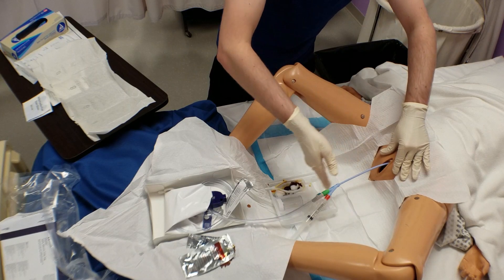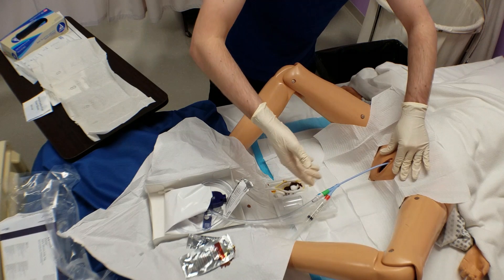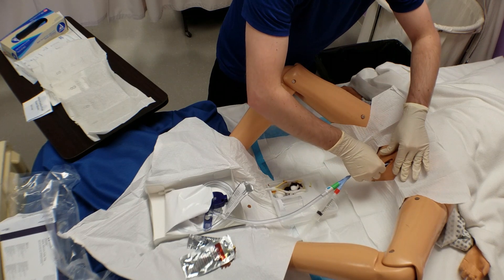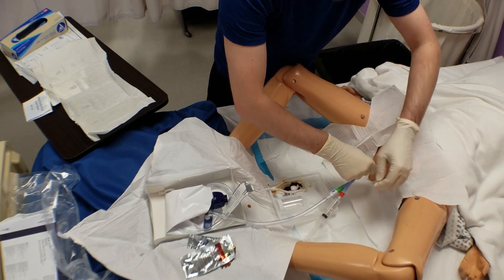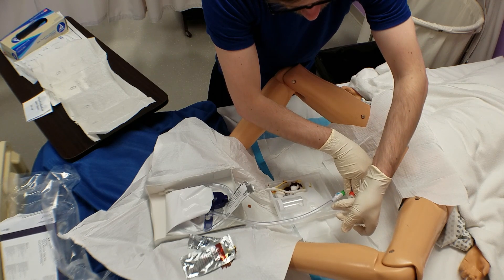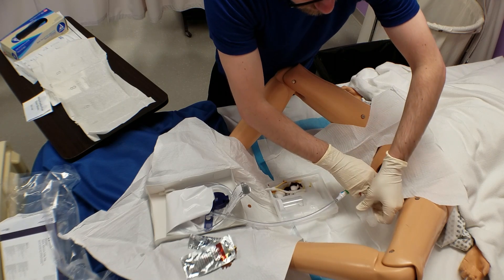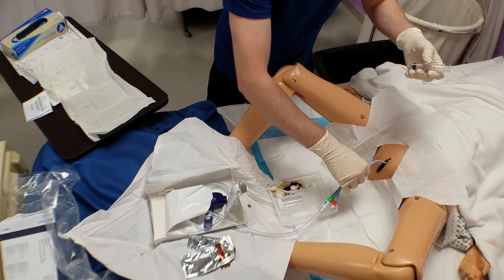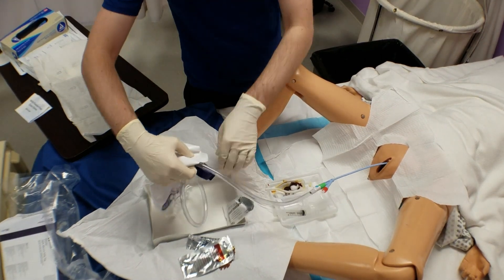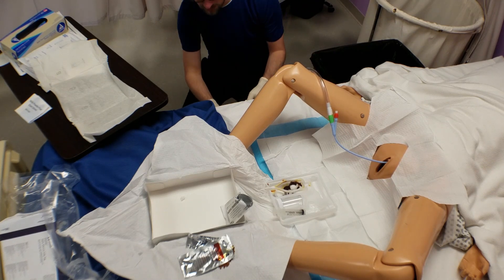Insert the tip of the catheter into the patient's urethra and advance it forward. Advance the catheter until you see urine flow return, which typically occurs after three inches of insertion in a female. Do not force the catheter if significant resistance is felt on real patients. Insert the catheter another one to two inches after urine return, then inflate the balloon by instilling the port with your sterile water syringe. You may remove your non-dominant hand from the labia at this time to inflate the balloon while stabilizing the catheter with your inserting hand. Once inflated, lightly pull on the catheter to ensure the balloon is preventing it from falling out. Lift the drainage bag and ensure there are no dependent loops in the tubing, and that the bag is hooked on a non-moving place at the foot of the bed.